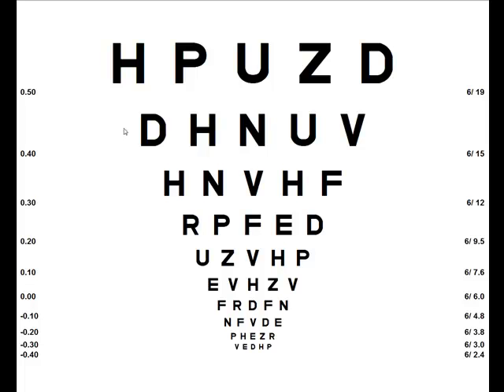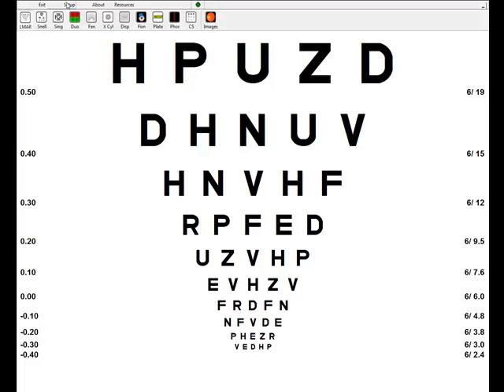When you first go into the program it will show you a logMAR chart as is shown on the screen at the moment. If you move the mouse cursor across the chart to the top of the screen it will bring down a little toolbar which will show you the 11 principal modes of TestChartExpert.